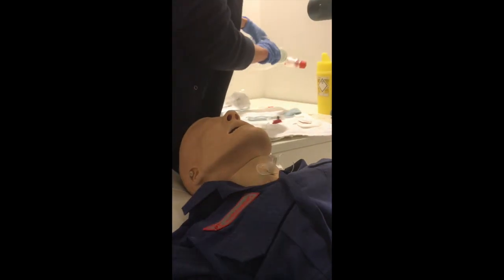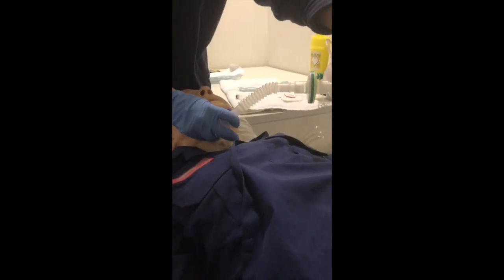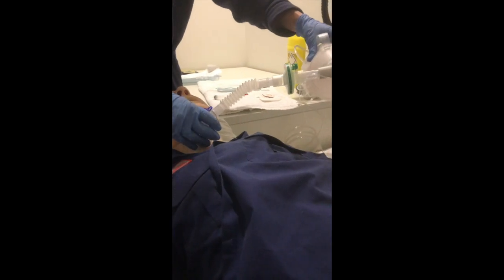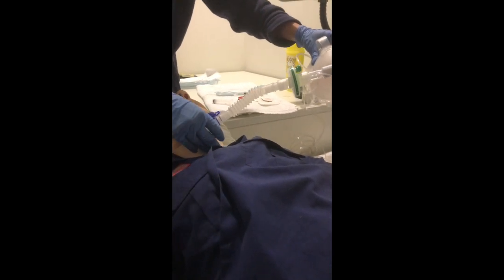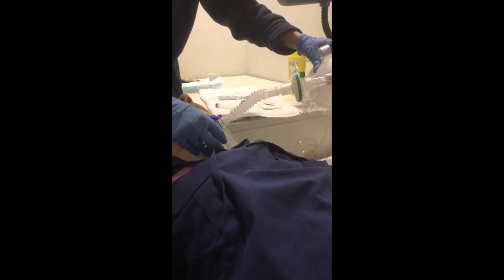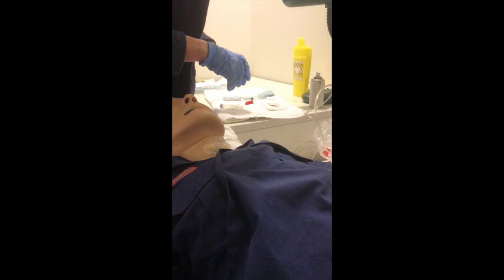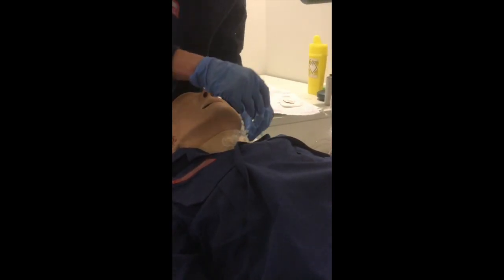and then we're going to confirm our position with ventilation, looking for chest rise and fall. We want to initially give 1 to 2 rescue breaths, aiming for 6 to 7 mils per kilo. Once we have this confirmed, we would then get a second person to continue our ventilation, 6 to 7 mils per kilo at 12 to 16 breaths per minute, or whatever is clinically appropriate, and confirming with an end tidal reading as well. Bearing in mind we may need 6 or 7 breaths to be able to confirm an appropriate waveform.